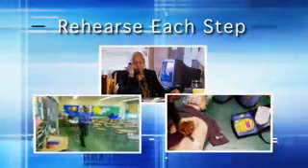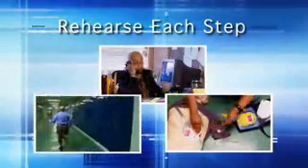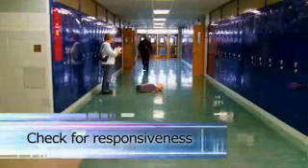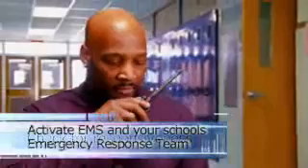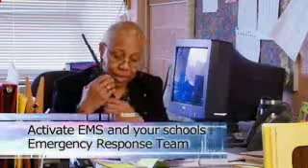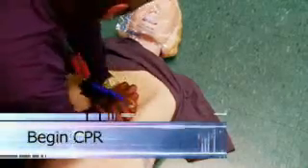When conducting a drill, it is important to carefully rehearse each step of the response, just as if it were a real emergency. First, check for responsiveness by tapping on the victim's shoulder and asking, "Are you okay?" "Are you okay, Miss Jones?" If they don't respond, get help. "This is Harold Smith. Activate your school's emergency response." "10-4. Call 911. Start CPR, and get the AED immediately."